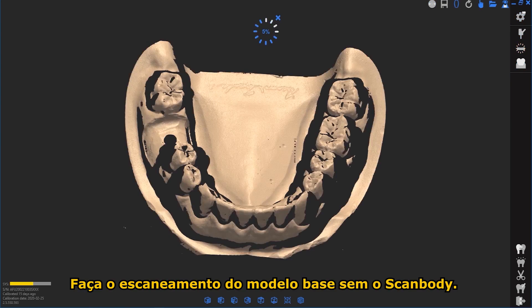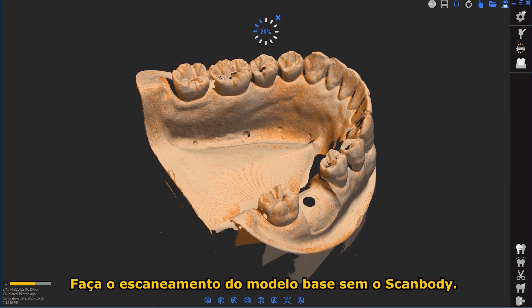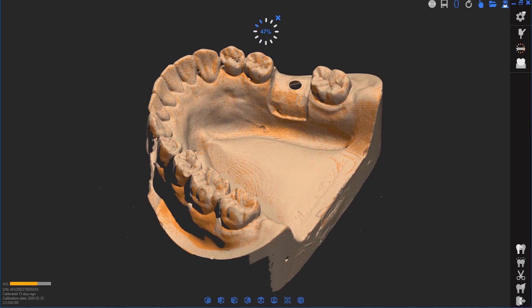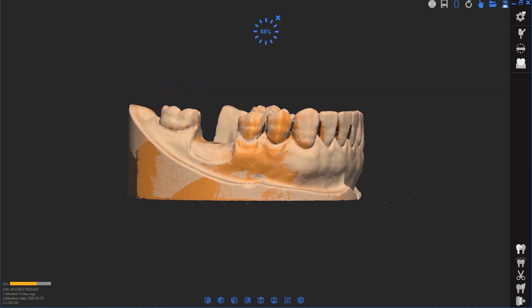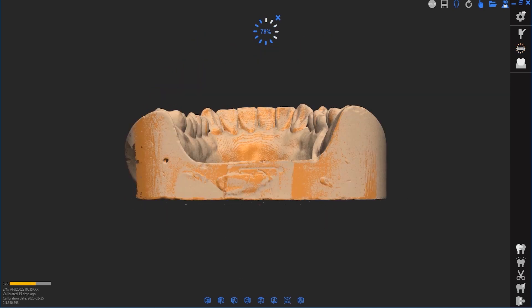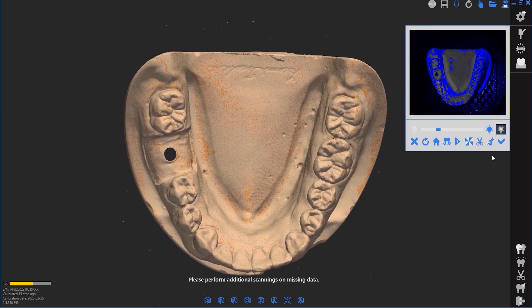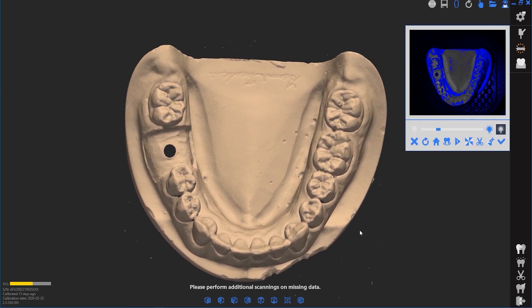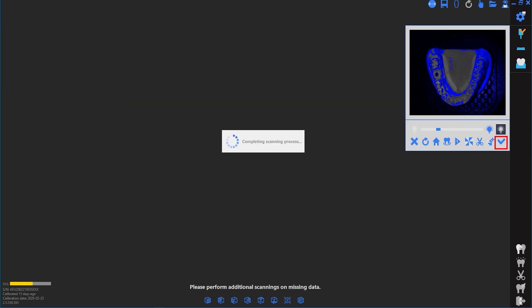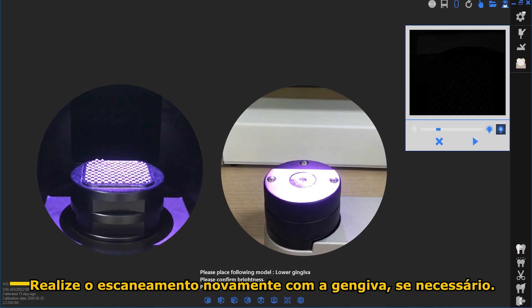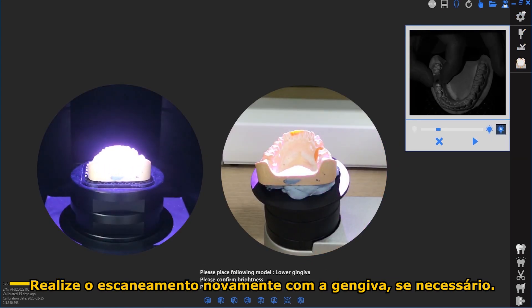Scan the base model without the scanbody. Scan the base model again with the gingiva, if necessary.